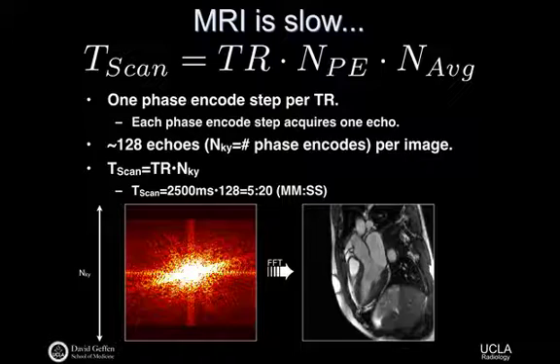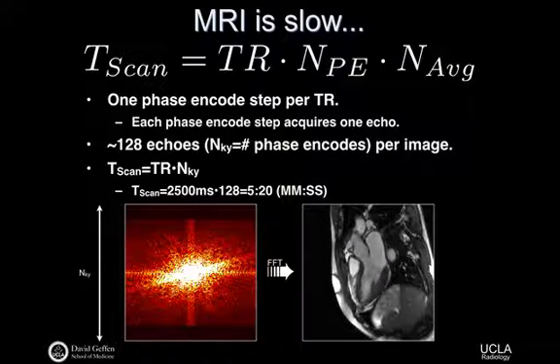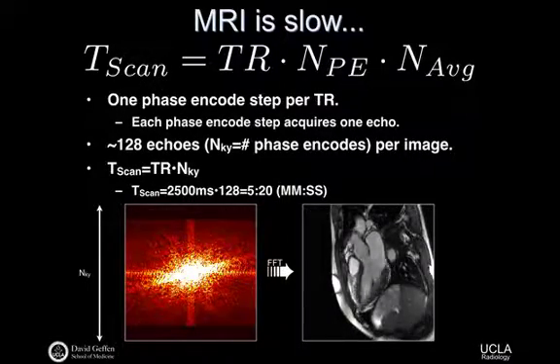So in MRI, resolution is a little tricky, but we're typically talking about the number of data points along a single direction on the order of 128, maybe less, maybe as high as 256, and it's hard to get out of that range generally. Whereas mammography or high-res CT might push up to 1024, so that's the order of magnitude in rough terms.